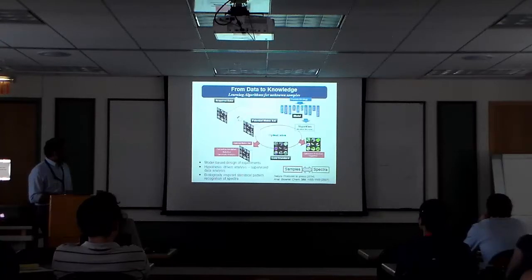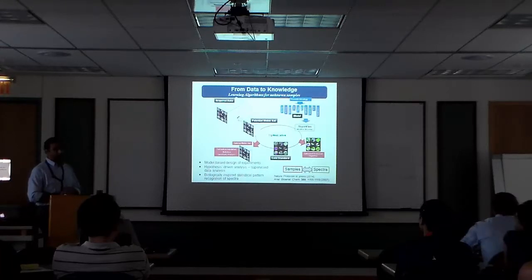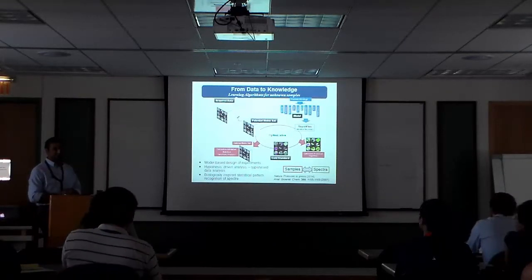The way we do this is we take our data set. So we acquire a lot of data. We have, on the side, molecular biology experiments, right? So we do some basic cell culture experiments, some basic tissue culture experiments, and then we say that only these features are important, right? So this is a biology-informed feature down select. And we go from this large set to a smaller set.